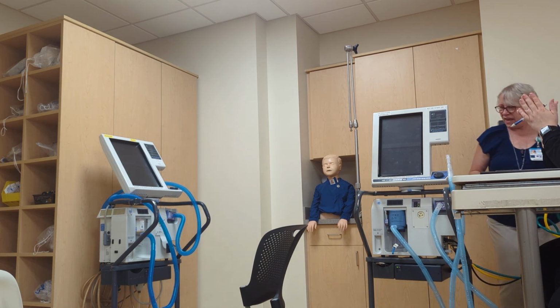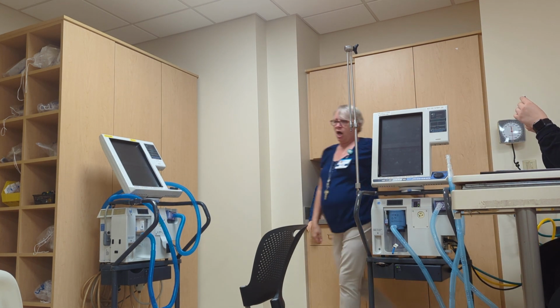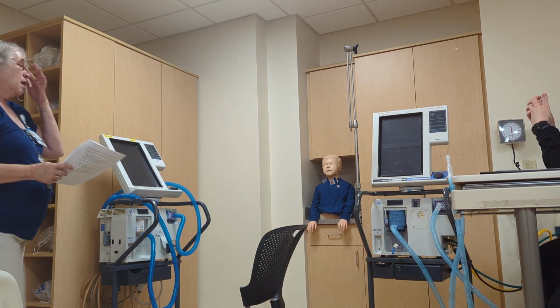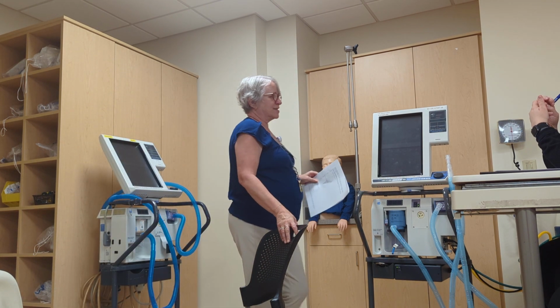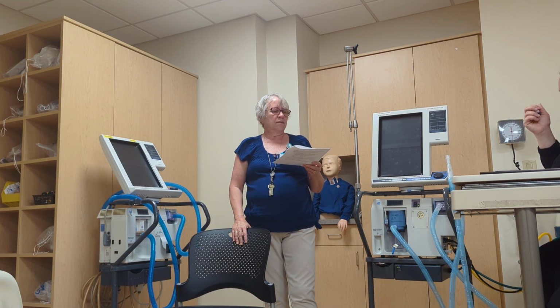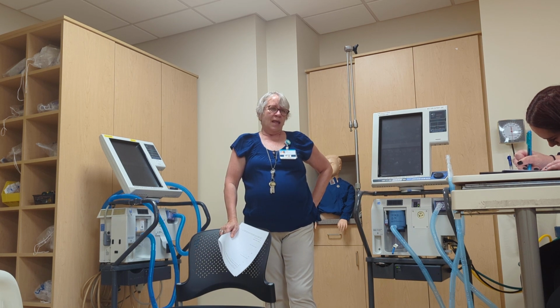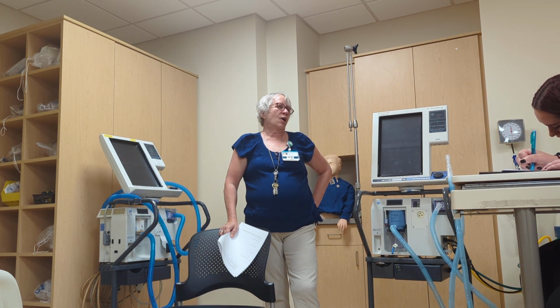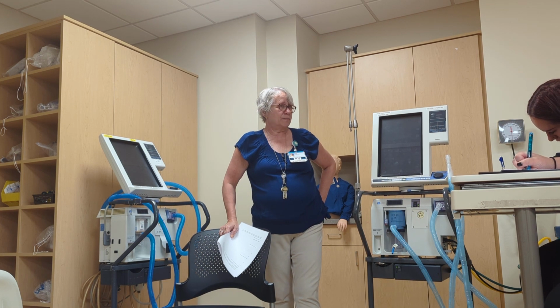All right, with all ventilators, when you turn them on, well, I guess we'll start with EST, okay? An EST is called an extended self-test. That's an EST, extended self-test. And the purpose of that EST is to make sure everything on the ventilator is running properly. All the mechanics, all the internal guts, everything. And it's also to make sure that your ventilator is calibrated, all right?